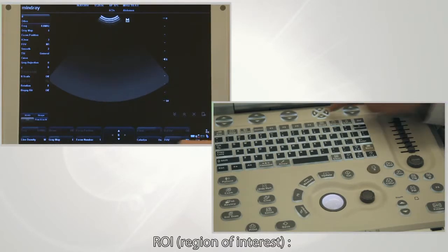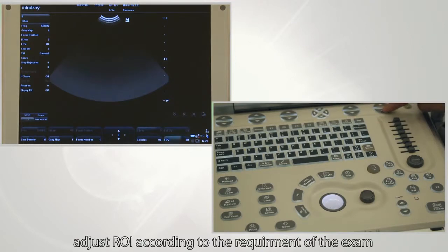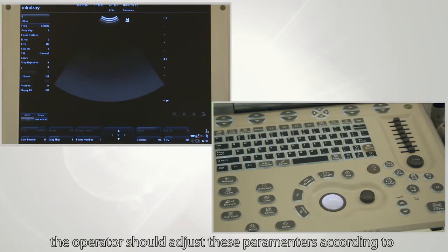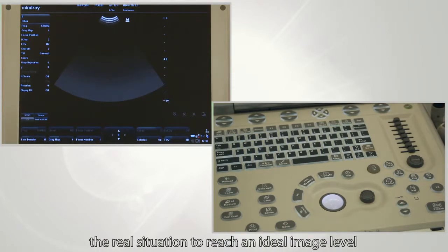ROI refers to region of interest. Adjust ROI according to the requirements of the exam. During the scanning process, the operator should adjust these parameters according to the real situation to reach an ideal image level.